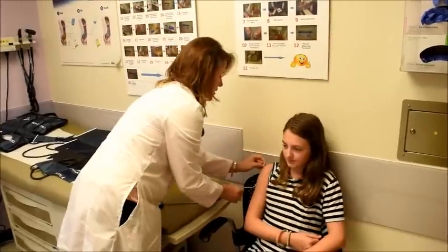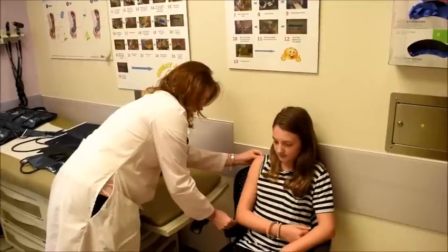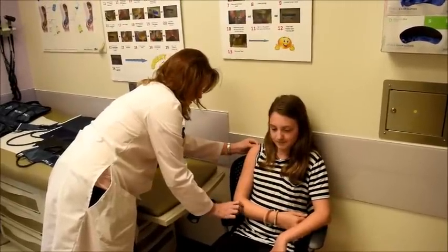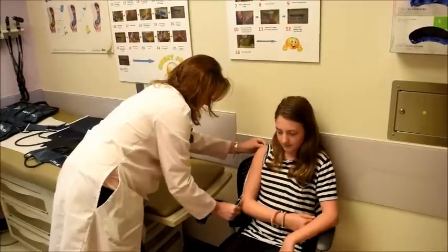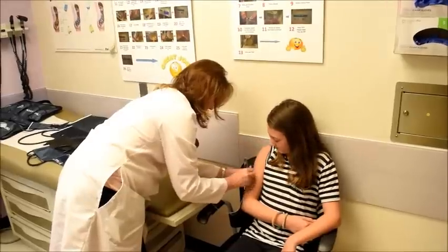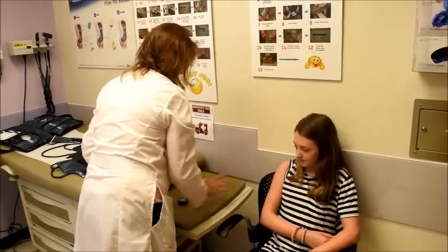And so you measure between, again, the acromion, or the bony prominence of the shoulder, to the tip of the elbow on the dorsal aspect of the arm. And for Chelsea, we have 32 centimeters. So half of that would be 16. And so you'll take your pen, and you're going to want to mark where that is, so that you can remember where you need to place the cuff, or the tape measure.